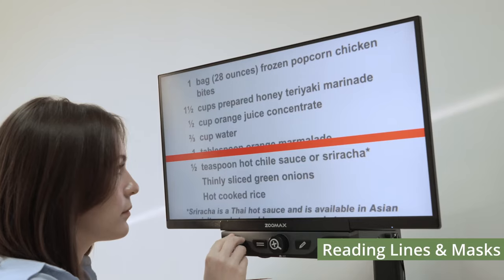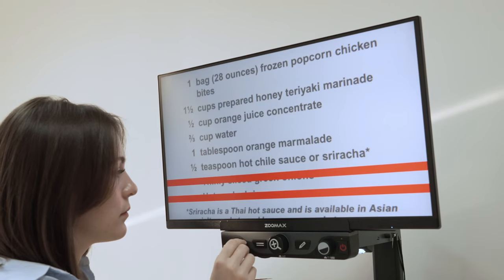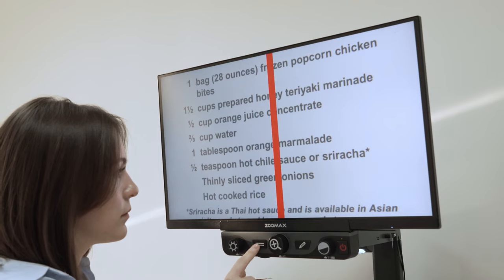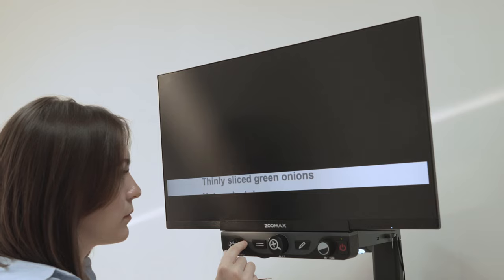Reading Lines and Masks: push the Positioning Auxiliary button to cycle among the available reading lines, and then pick the one you like. Reading Lines and Masks help users in tracing text and make it easy to keep track of your location when you're reading.